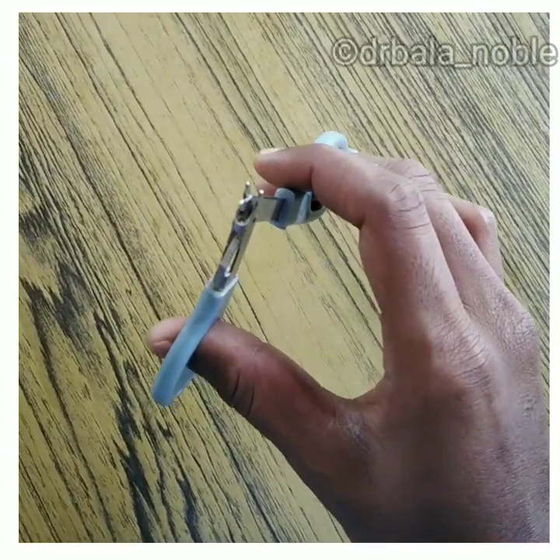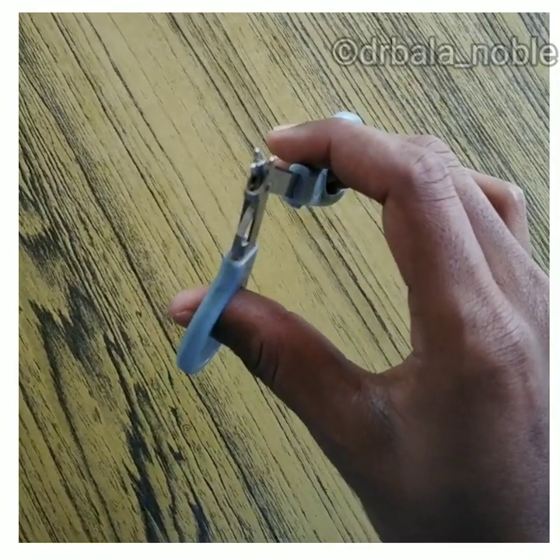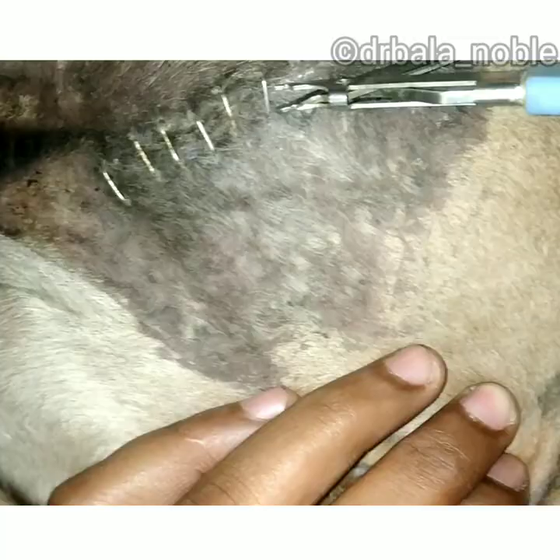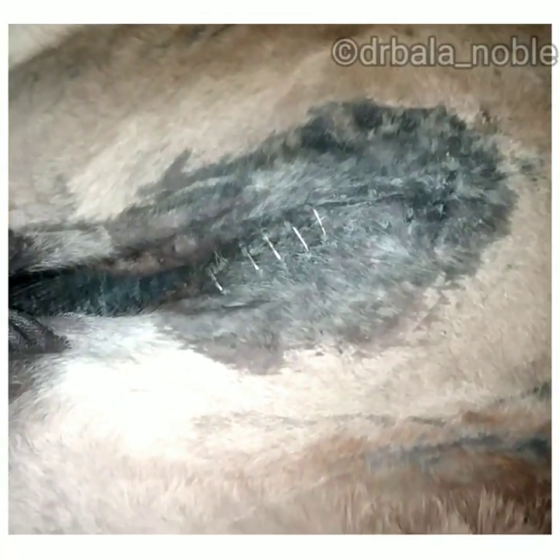Next we are going to remove the staples. This is the staple remover. As you know, the pin will be folded inside like this, so you have to insert the pin remover like this, then press so the pin will unfold and come outside. It is at the umbilicus — it was stapled after an umbilical hernia correction.